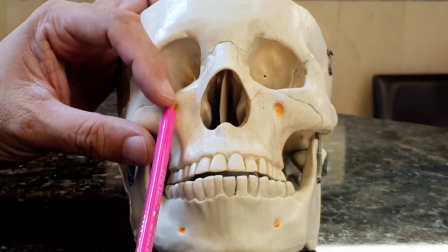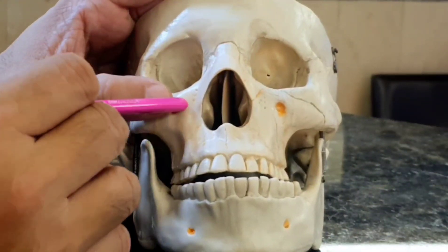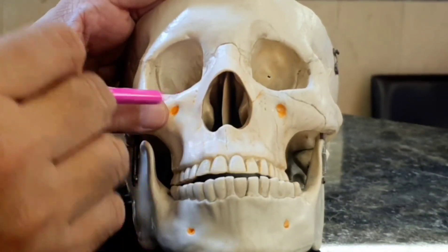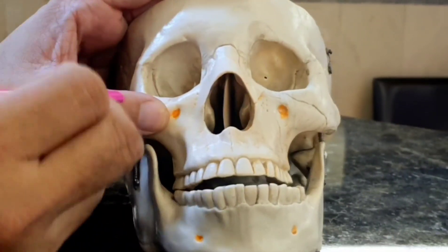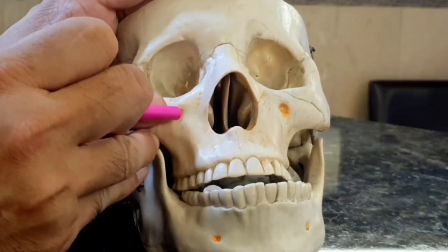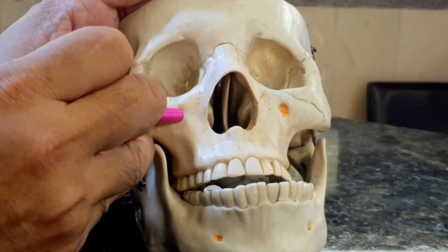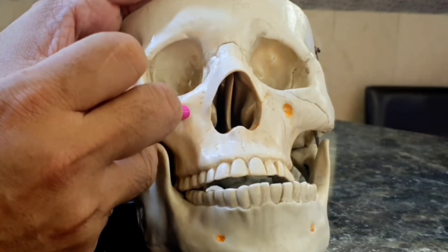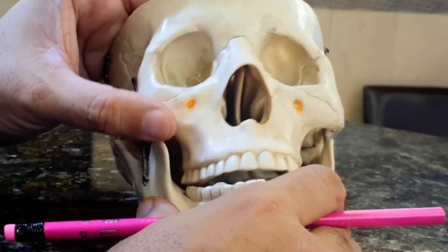In case you're not able to give it from the inside, you can go from the outside of the mouth. You would palpate the notch or the foramen and with a very short needle, don't aim it towards the eye — come from the side. In case the patient moves or slips, you won't puncture the eye. You can go into that notch only a millimeter or two and deposit your anesthetic there, and you'll be able to get the whole area.